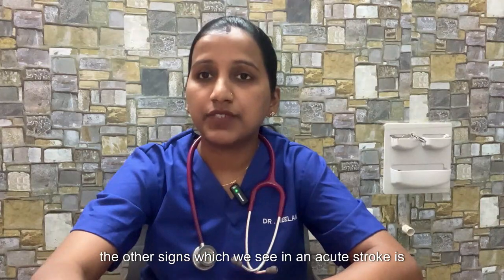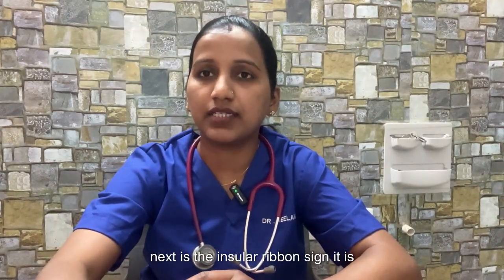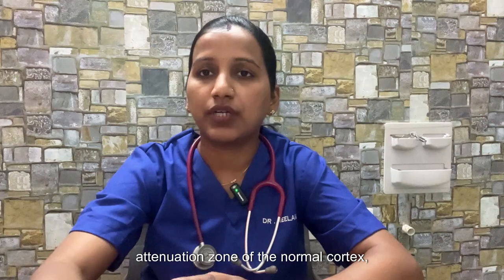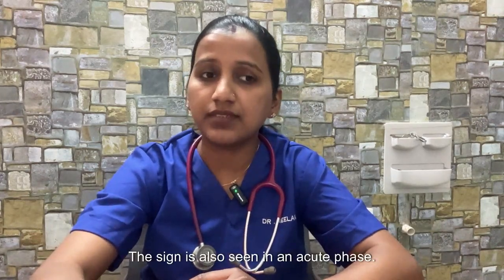The other sign which we see in an acute stroke next is the insular ribbon sign. It is basically the absence of the thin high attenuation zone of the normal cortex which is present medial to the sylvian fissure. This sign is also seen in an acute phase.